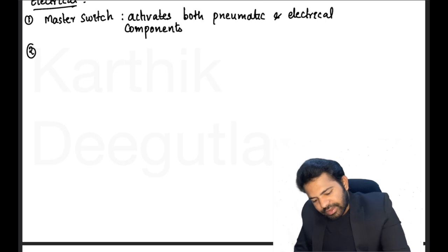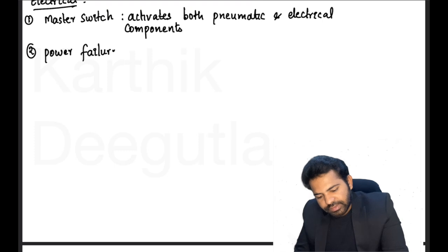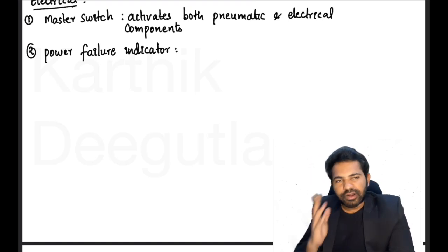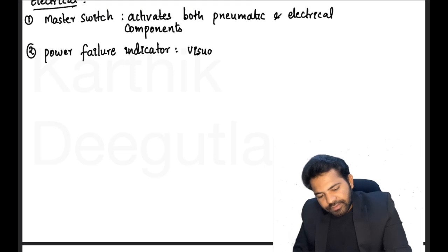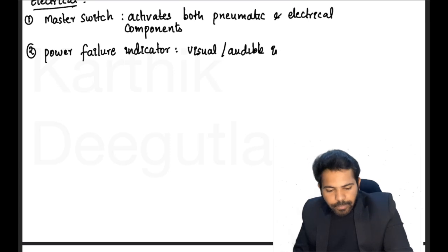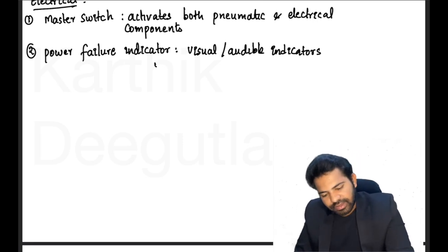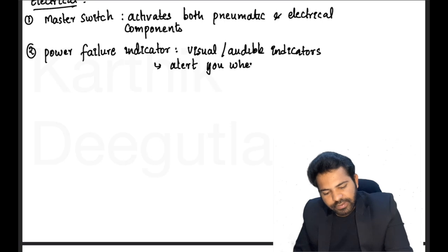Now moving on, the second thing is the power failure indicator. The power failure indicator can be a visual or audible indicator. This will alert you when power is lost.